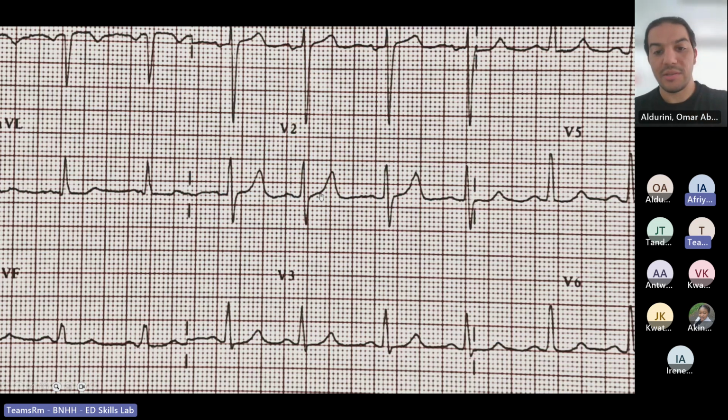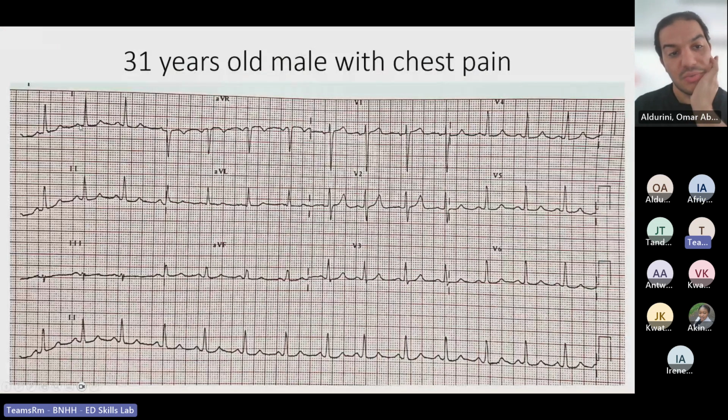Yes. This is what we spoke about earlier about the conduction. As you can see, each lead looks at a different angle. From the angle of V2, the T wave has this shape, and V3 has this shape, and it's different in each lead. But from the normal point of view, this T wave looks normal.